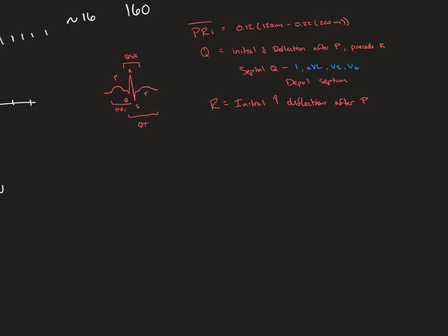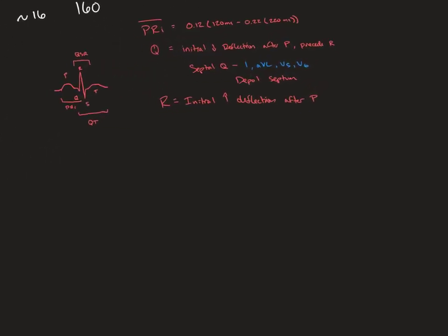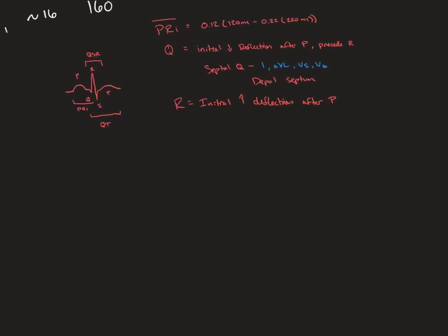It demonstrates the primary ventricular depolarization. So we'll go over the direction of the electricity, which will make more sense. And each lead has a varied representation of that. So the R wave is typically heavily present in lead 2, which is our rhythm lead, because of its proximity and its direction facing that left ventricle, which is where most of that electricity is moving toward.